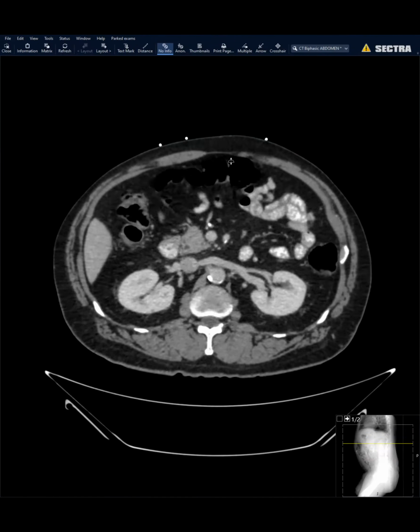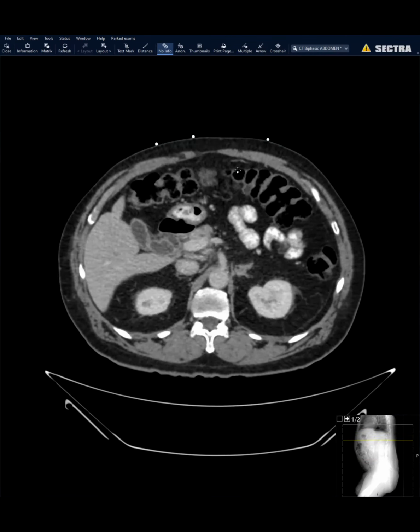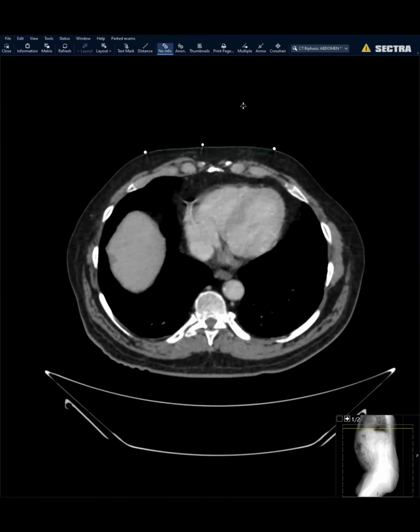History: just some pain, bile duct dilatation and a transition in the lower bile duct. Right. So based on that, we thought of a differential diagnosis.